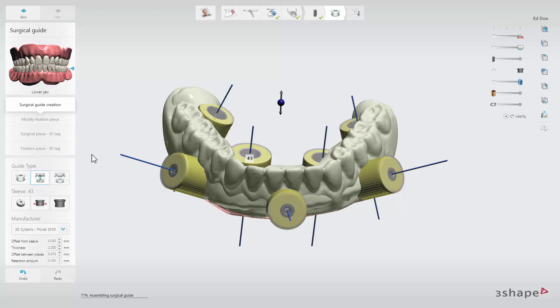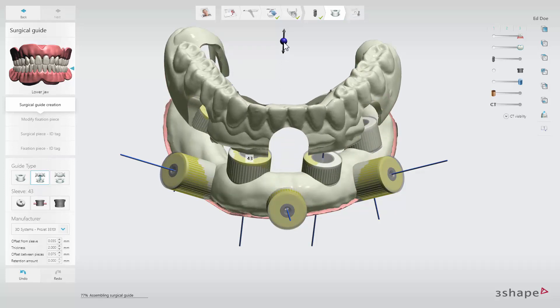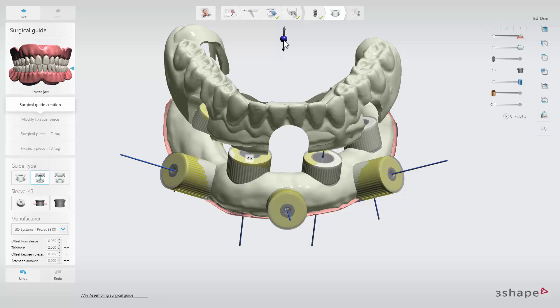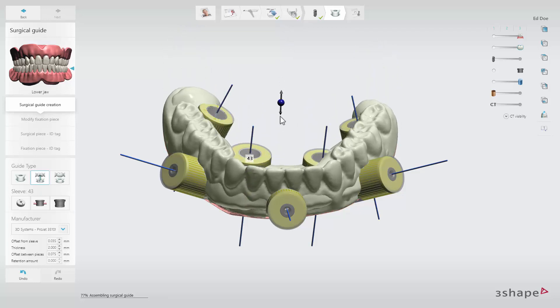A two-piece guide is a guide in two pieces that fit on top of each other. The bottom piece is as small as possible and contains both the anchor pin supports and sleeve supports. The second piece goes on top of the bottom piece and has the teeth from the denture on it. This is useful if you have accessibility concerns, as you can remove the top piece before starting to drill for the implant placements.